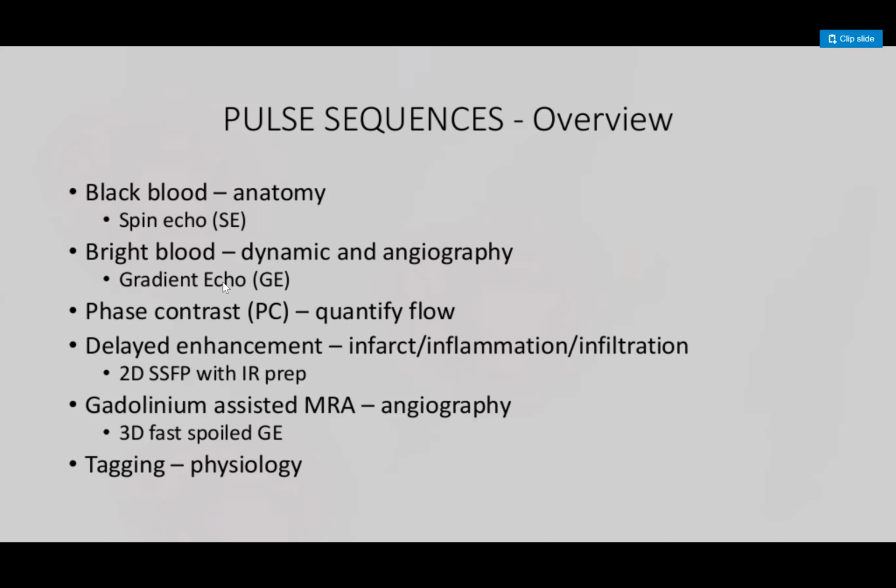So we don't talk about T1 and T2 weighted imaging in these sequences because every image is using both T1 and T2 times. So you cannot say which one is more. What people started doing is that they just made it simple. If the blood is black, it's black blood imaging. If it's bright blood, it's bright blood imaging.